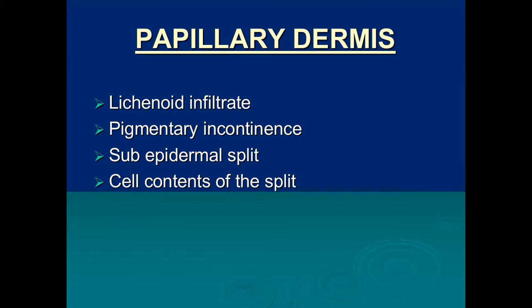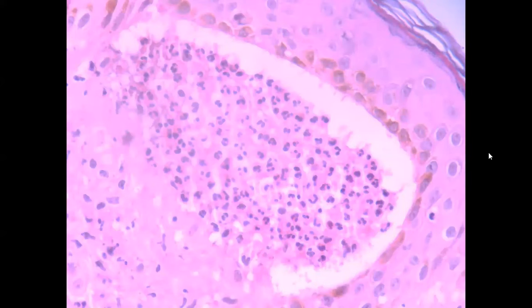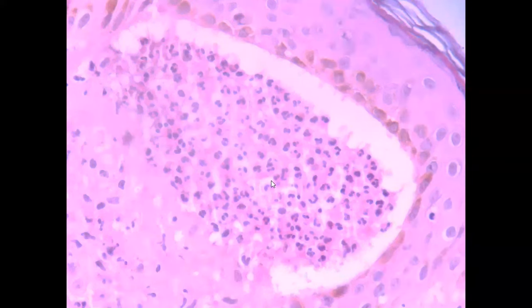In the papillary dermis, we look for lichenoid inflammatory infiltrate, pigmentary incontinence, subepidermal split, and different inflammatory cells within the subepidermal blister. This picture is a magnified image of papillary tip neutrophilic micro-abscesses — you can see one dermal papilla with dense neutrophilic infiltrate and a split. This is a typical feature of dermatitis herpetiformis: papillary tip neutrophilic micro-abscesses.